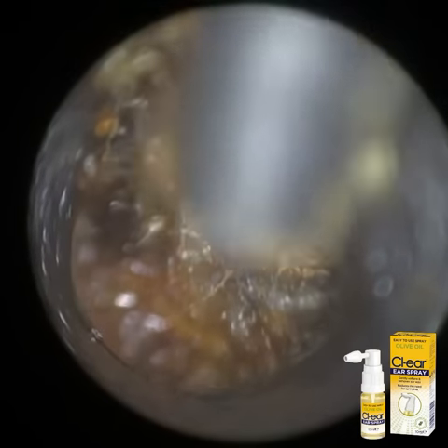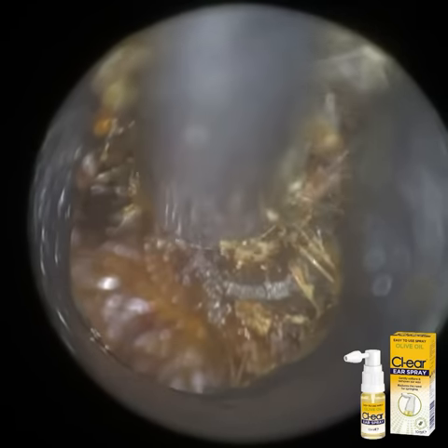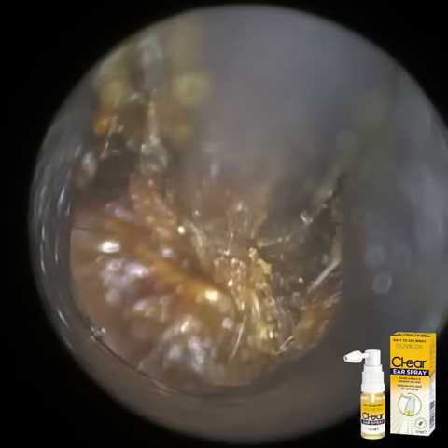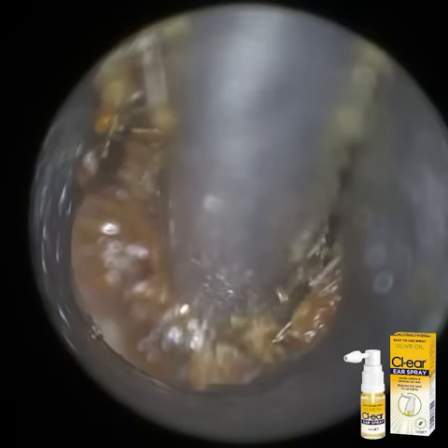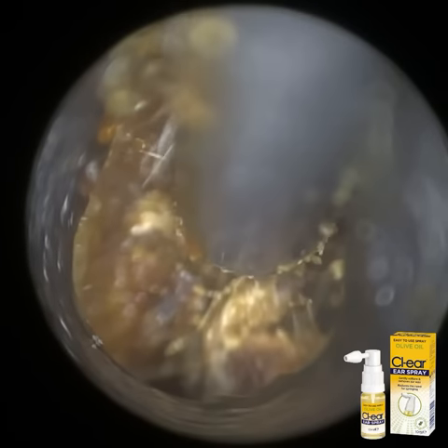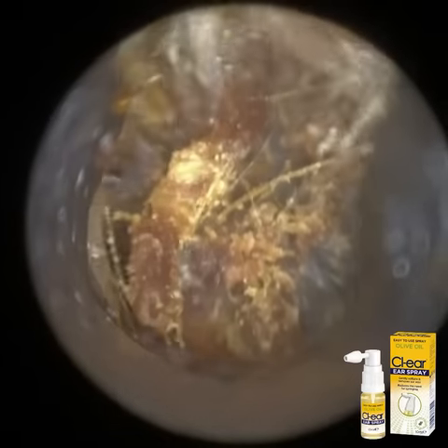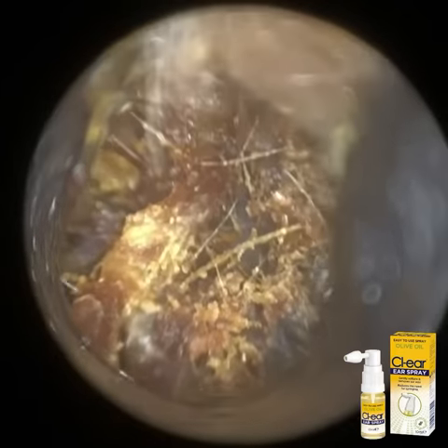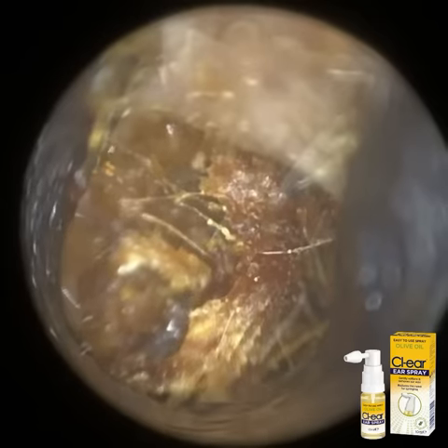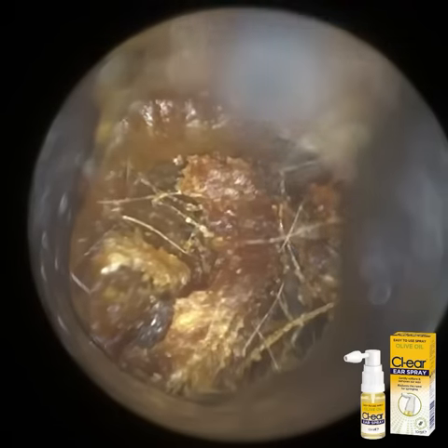Now I'm using our 4.25mm speculum here. We have got three other different sizes. We've got a smaller size, a 3.5mm. You can't really go any smaller than that for the purposes of earwax removal, because then you won't have any maneuverability with the instrument itself. And we've got a larger size than this, which is a 5mm internal diameter, and then we've got the largest one, which is our 5.75mm for extremely large ear canals.